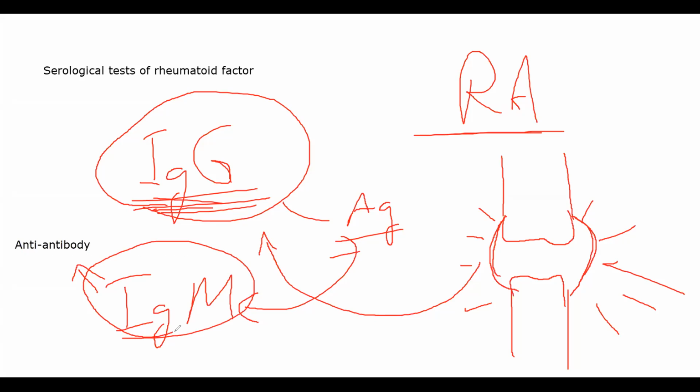To demonstrate these rheumatoid factors, you take serum and react it with IgG. You coat it with latex particles and perform an agglutination test. If clumping happens between IgM and IgG, you know that rheumatoid factor is present. Normally IgG and IgM should not clump. Whenever you are testing for this rheumatoid factor, if IgM against this IgG are present, an agglutination reaction will occur.